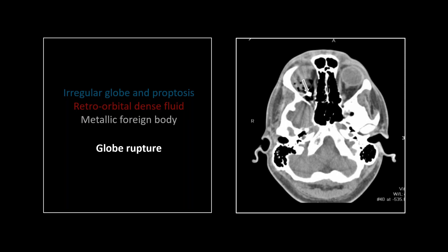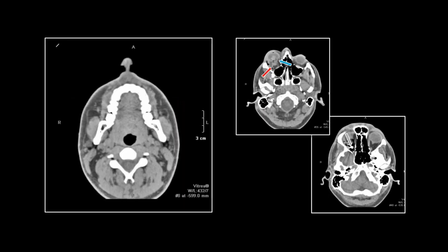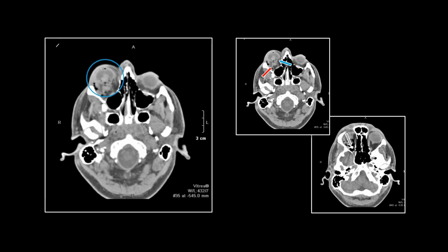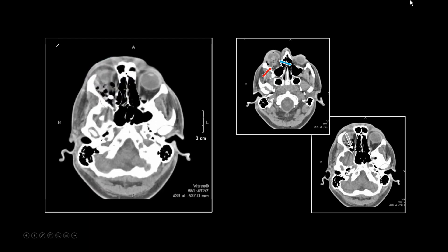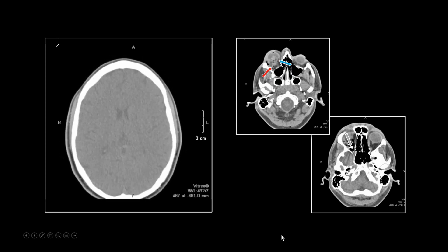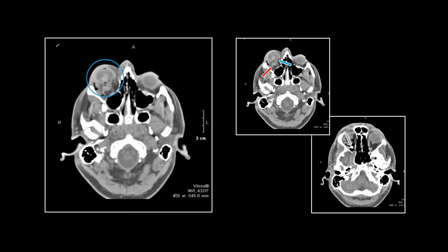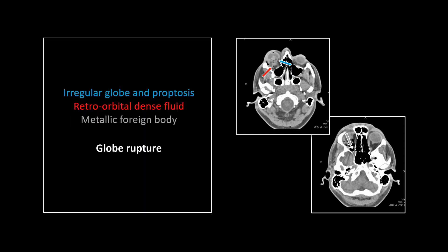Higher up, you can see the culprit. Obviously, you'll shoot your eye out — we all know how dangerous these things are, even without the movie. And a nice example of that globe distortion, the buckling there at the back aspect of it, clearly denoting a rupture. The lens really took it directly, it looks like. There's really no lens tissue remaining. That's a globe rupture.